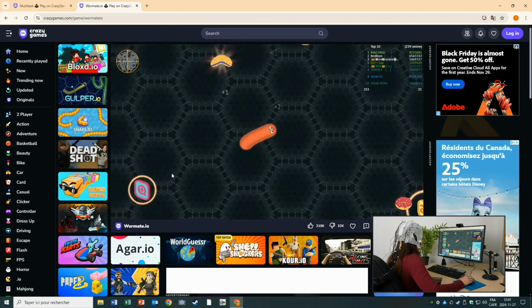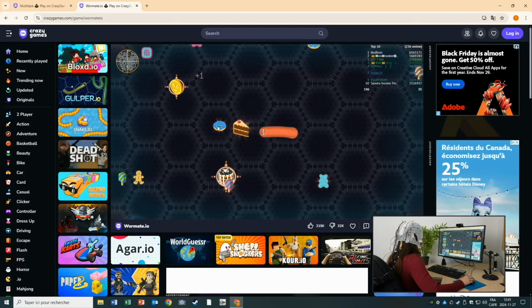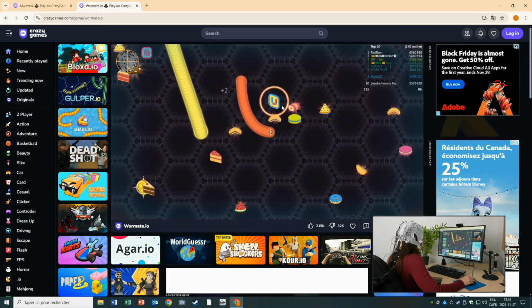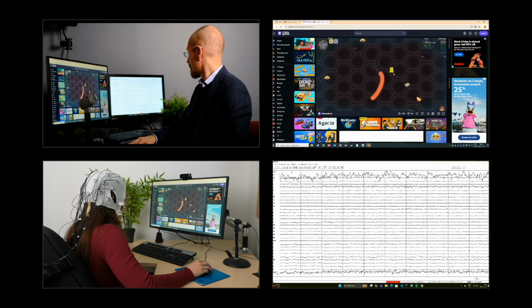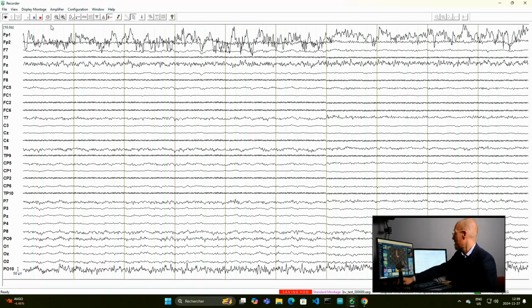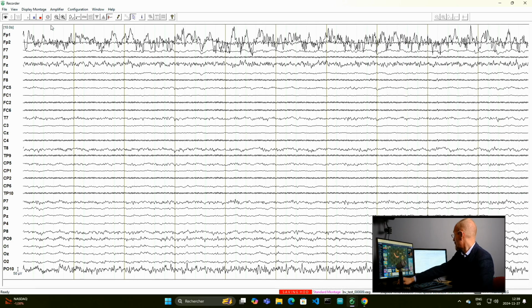So, Anne, your job is to eat the food. Now that Anne has started the game, I'm going to enter my marker. Maybe you couldn't see that, so I'll enter in my marker one more time. We'll wait for it to come around so you can clearly see it on the screen.